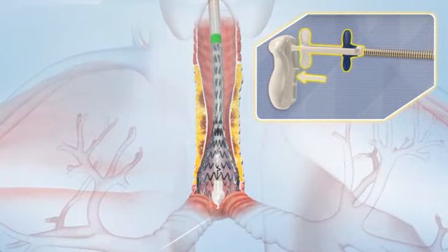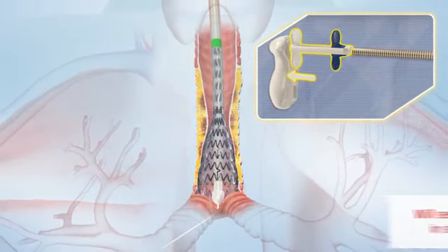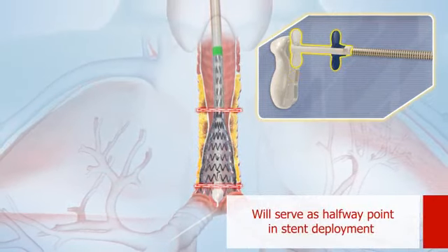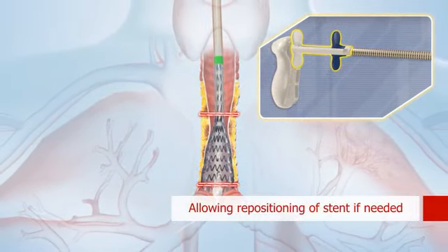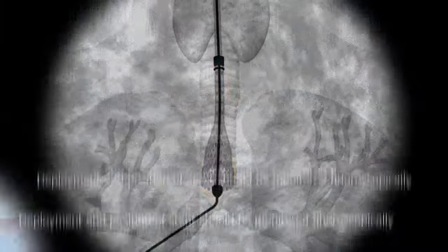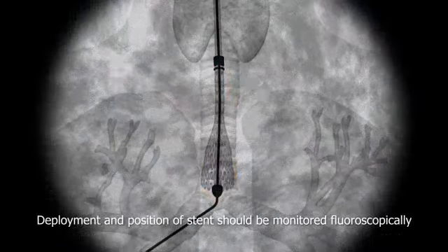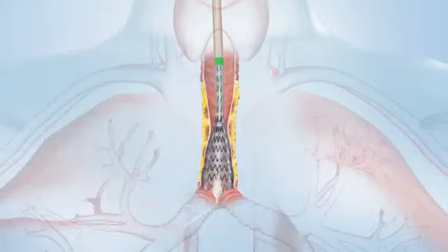Complete actuation of the first white trigger will deploy half of the stent. This will serve as the halfway point in stent deployment, allowing repositioning of the stent if needed. The deployment and position of the stent should be monitored fluoroscopically.